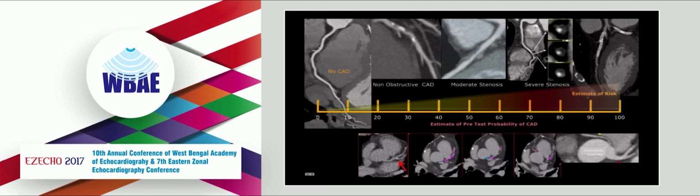If your question is to estimate risk, you have no better test than coronary artery calcification. Here are 4 examples of coronary artery calcium. The software will allow us to color calcific areas and quantitate it. Here is an example of an artery without significant stenosis, but there's a speck of calcium here. Even though there is no obstruction possibly in this patient, the very fact that there is calcification means he has coronary artery disease irrespective of any other testing.